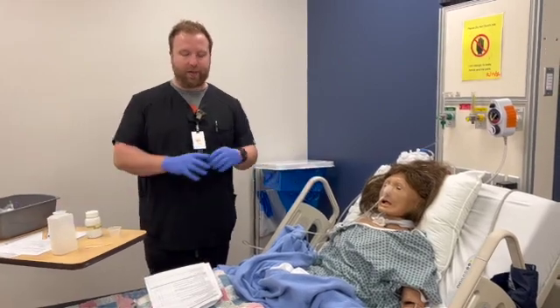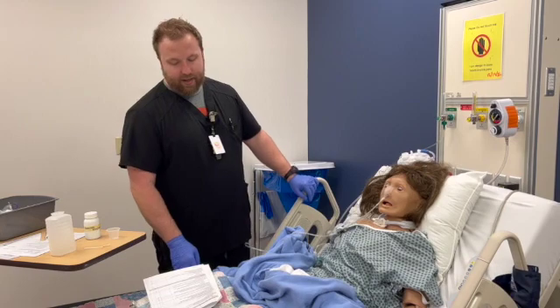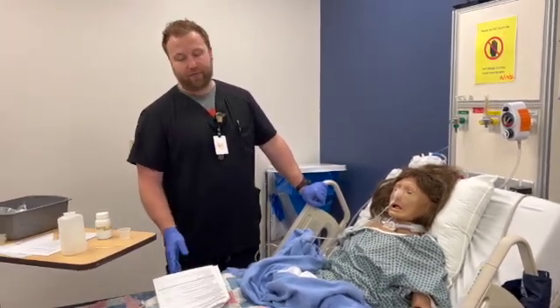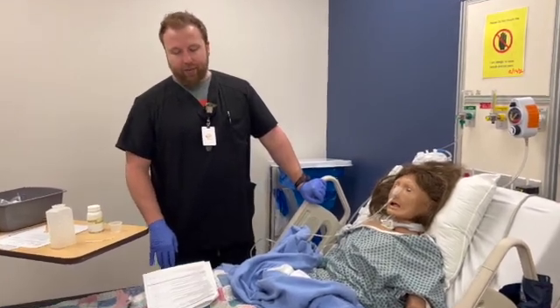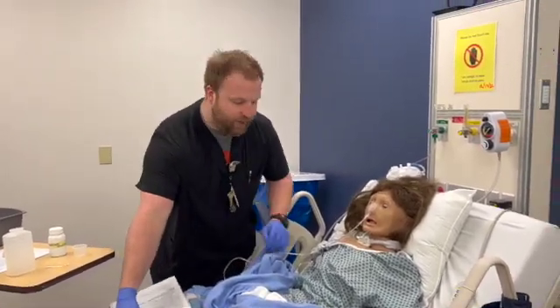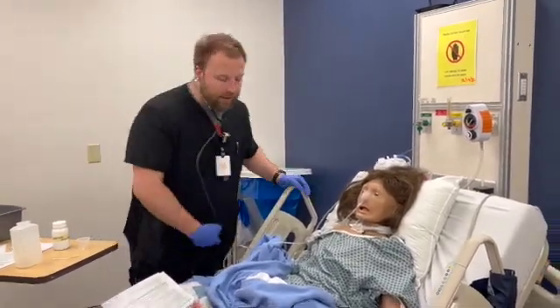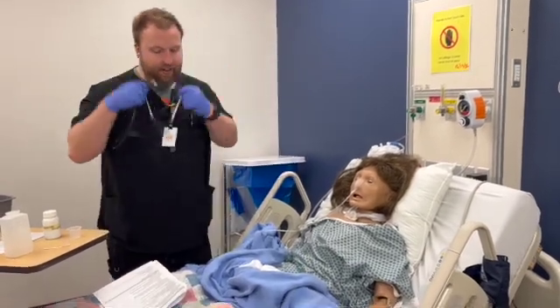At this point, I'll put on my clean gloves. If I have tube feeding, I would stop it, but I don't. If I had suctioning, I want to stop it, and I don't want to resume it for an hour after giving the meds. I will perform my abdominal assessment. I'm going to look. I'm going to listen, and then I'm going to palpate.